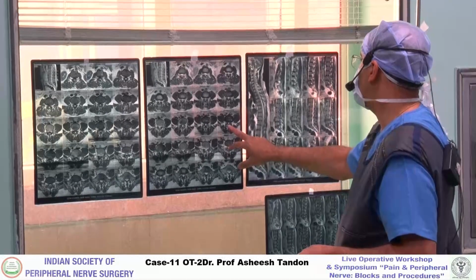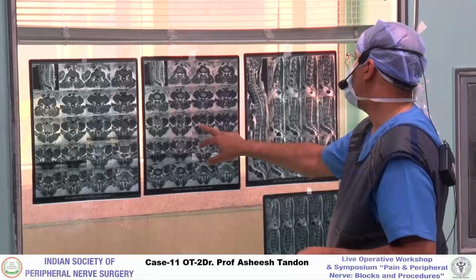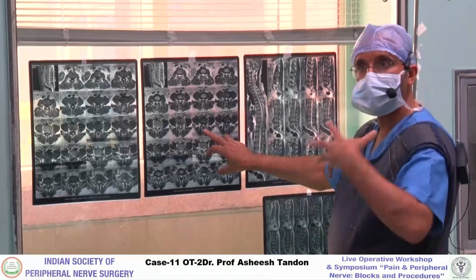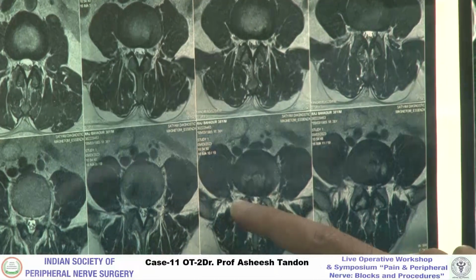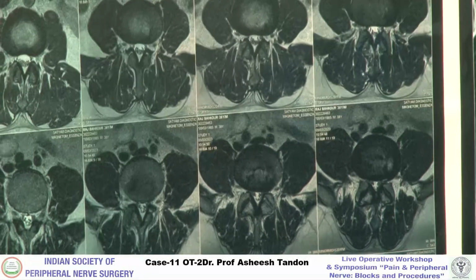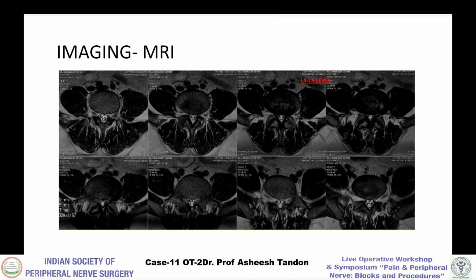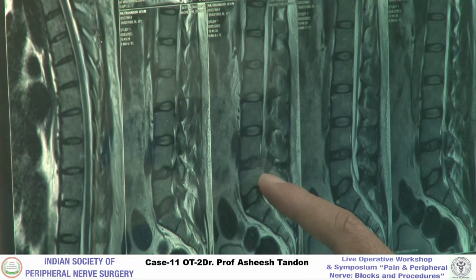There is ligamentum flavum hypertrophy at L4-5 level with bilateral lateral recess. Can you zoom in more? Zoom kar denge. So there is an element of lateral recess, again left more than right. Okay, and on SAG, here there is quite a thick ligamentum, with inferiorly there is compression.